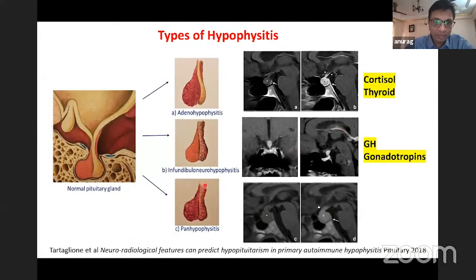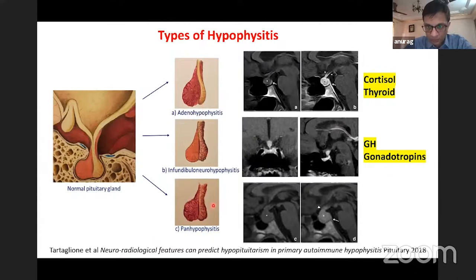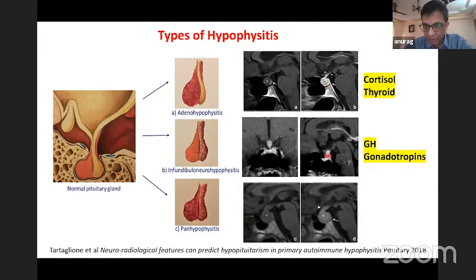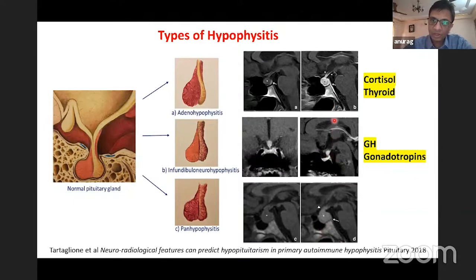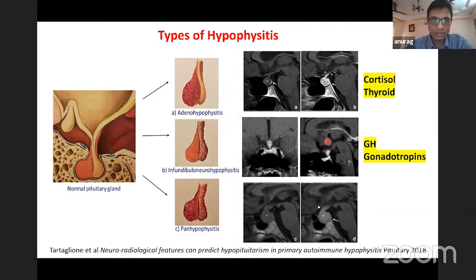Radiological classification of LYH depends on whether inflammation is restricted to the adenohypophysis, infundibulohypophysis, or both. Anterior hypophysis involvement gives classical thyroid and cortisol axis impairment. A V-shaped infundibular thickness correlates with diabetes insipidus, growth, and gonadotropin involvement, and it can be a mixed picture in panhypophysitis. Radiology can thus predict which hormone axis will be preferentially involved.